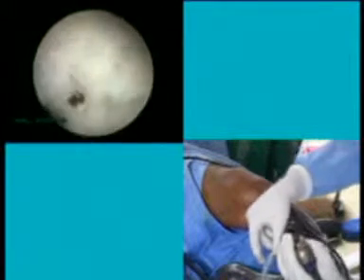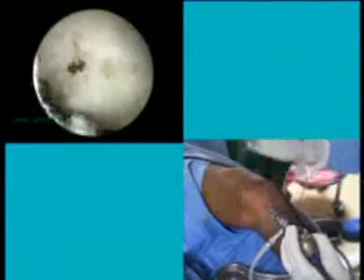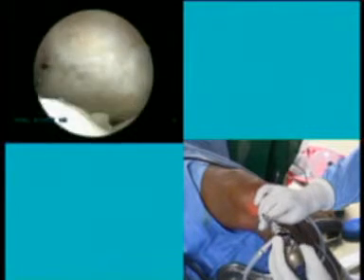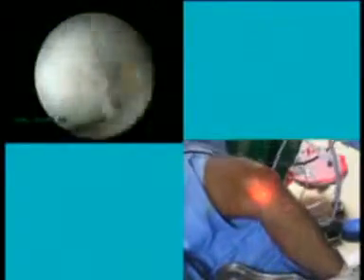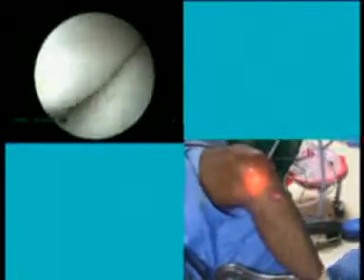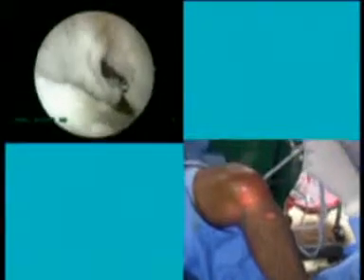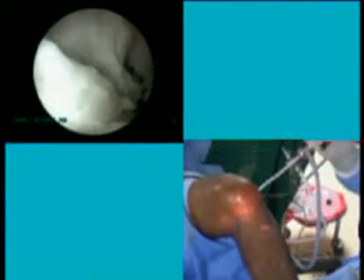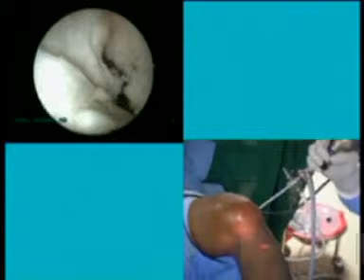So the guide wire that you have put, is that meant for the AM tunnel? That would be AM, yeah. Okay. I hope that you all agree. And then I would be happy to place my PL here. Okay, then we can start doing this. For ACL double bundle reconstruction and also for my single bundle reconstruction, I always use the medial portal technique for drilling. Can you give me the aimer, the 8 millimeter with the 8 millimeter offset?